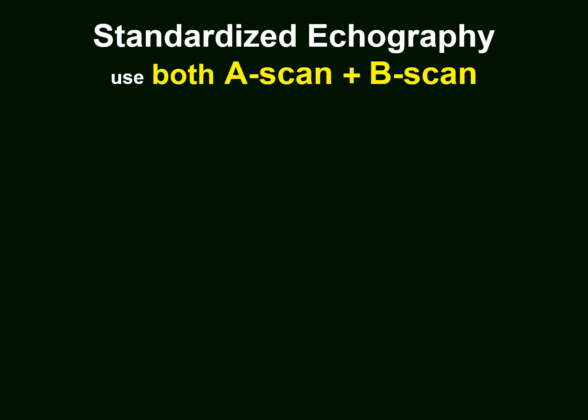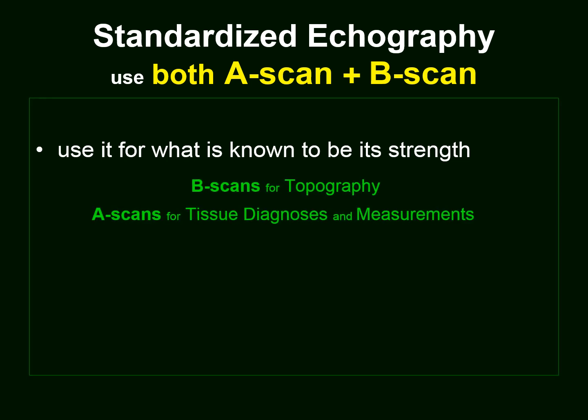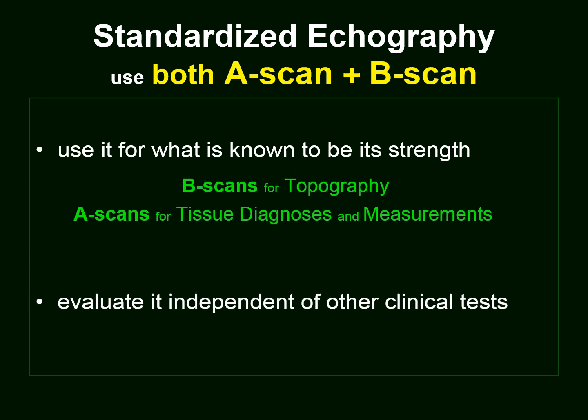So standardized echography uses both A-scan and B-scan. One should use each modality for what it is known to be its strength. B-scans for topography primarily, A-scans for tissue diagnosis and measurements. And one should evaluate using echography independent of other clinical tests.